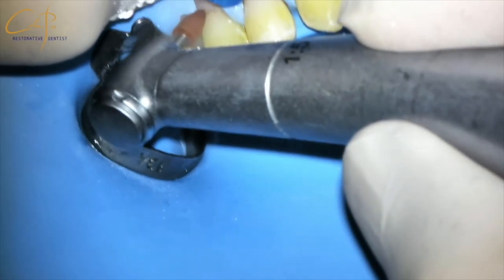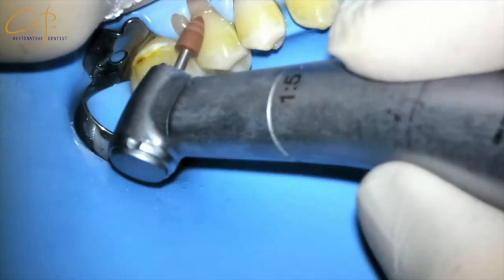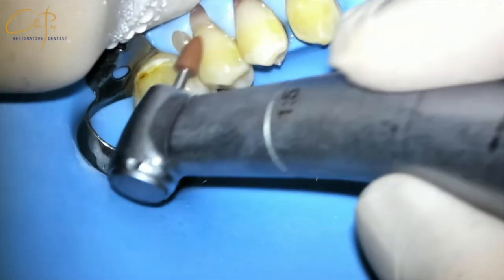I am using a polishing tip for the high speed, so make sure you reduce the speed of the micromotor to avoid heating. Also, don't put too much pressure, because the bur is quite active and can reduce composite if you apply excessive force.